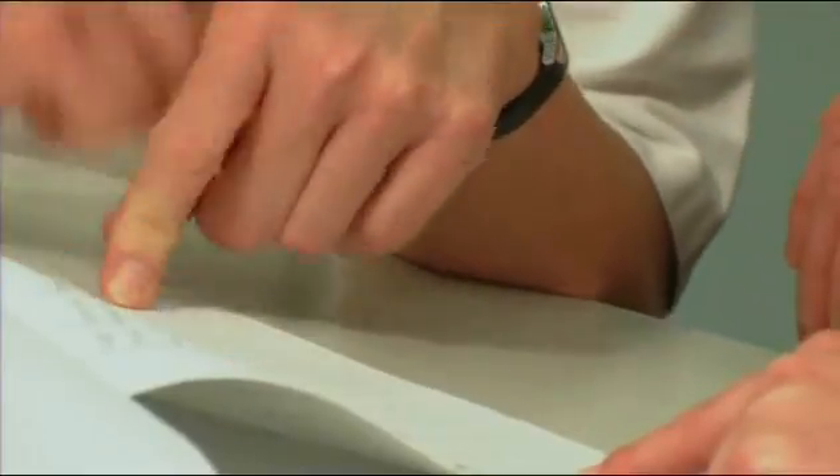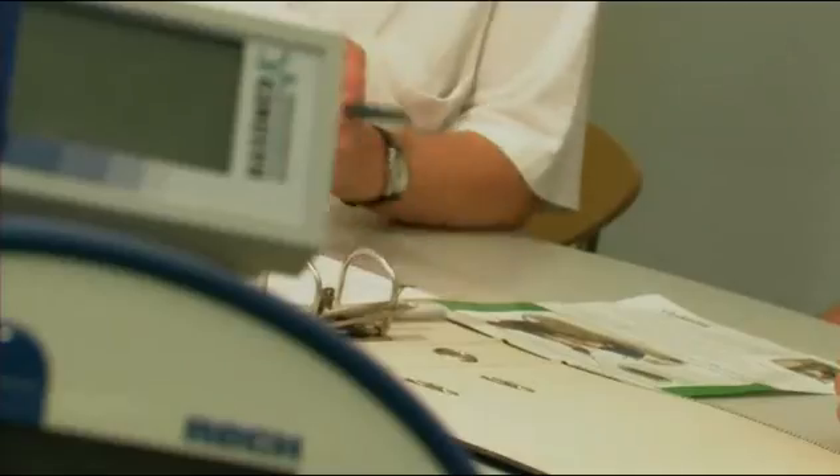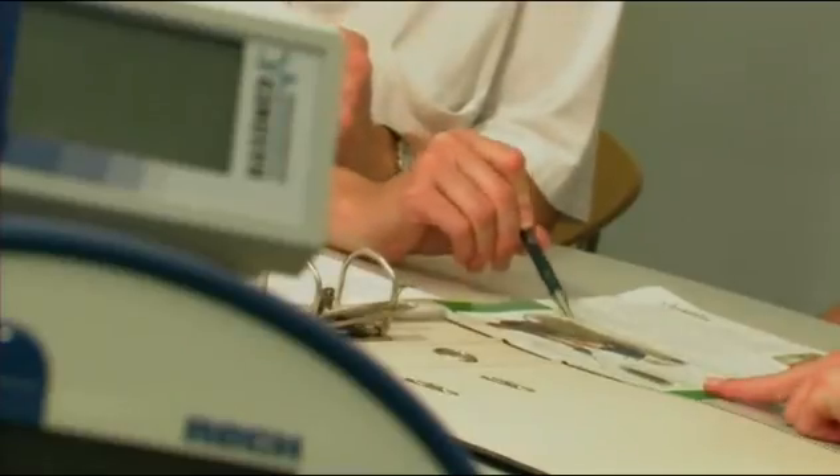With the referral of a physician, RehaMove can be used with hospital inpatients and also at home for regular active motion training. In particular, people with long-term impairment of their limbs ought to use this therapy option.